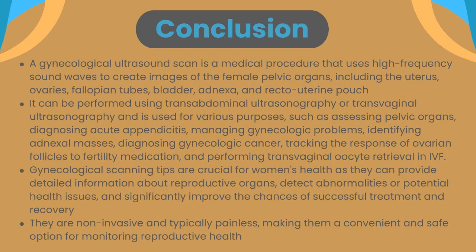So in conclusion, a gynecological ultrasound scan is a medical procedure that uses high-frequency sound waves to create images of the female pelvic organs, including the uterus, ovaries, fallopian tubes, bladder, adnexa, and rectouterine pouch.